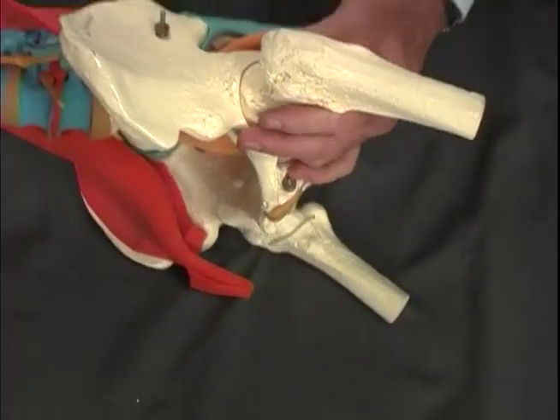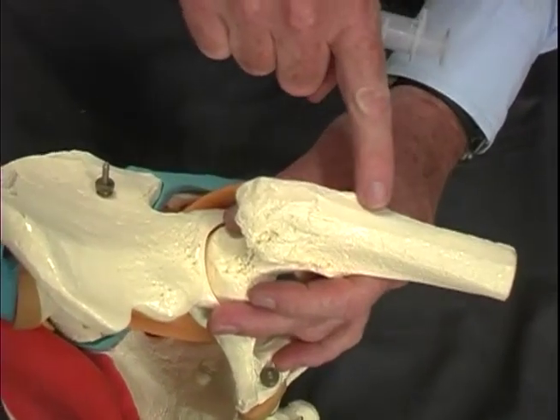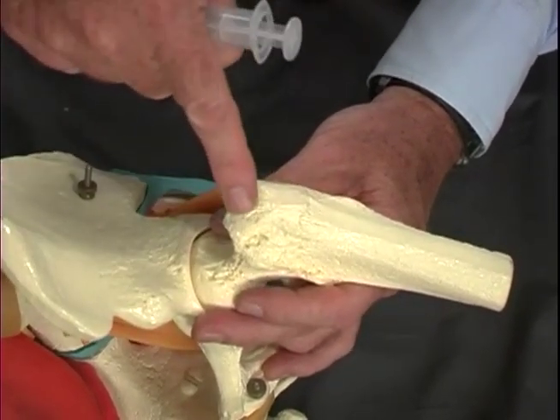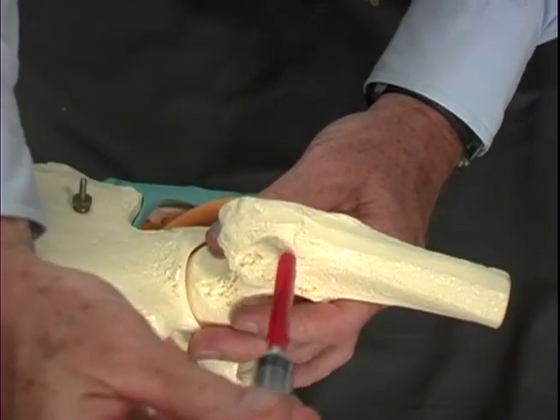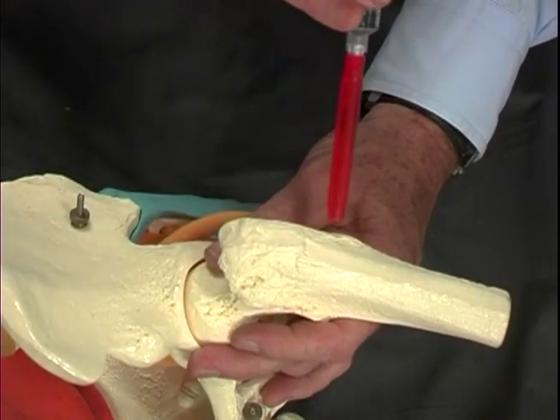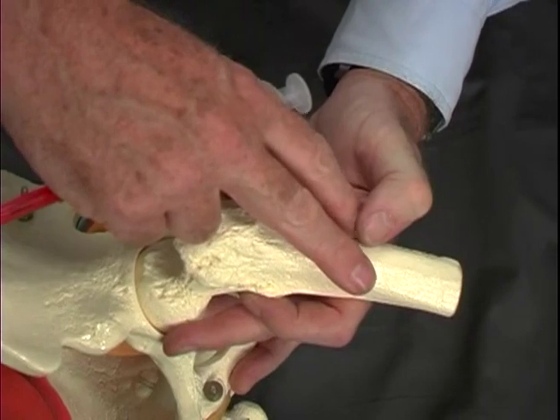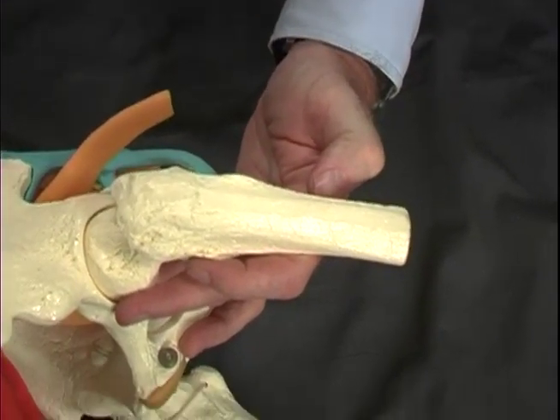To inject the trochanter itself, we need to turn the patient on their side, and again we feel all along the back of the trochanter, the top of the trochanter, and the front of the trochanter, as well as down the middle of the trochanter and down the femur. And then our injections should be carefully done all along those areas, covering as much of the trochanter as we can. And injecting then with our fingers locked over the femur, injecting right down the edge of the bone.